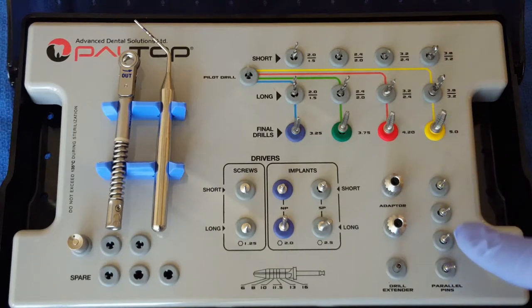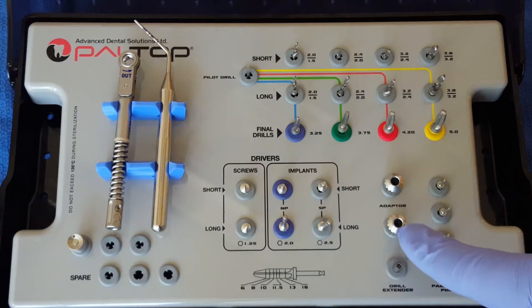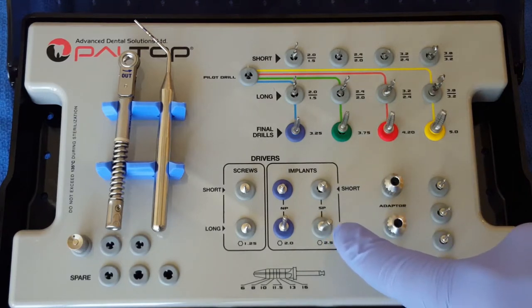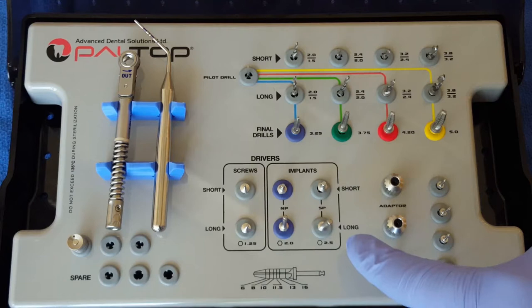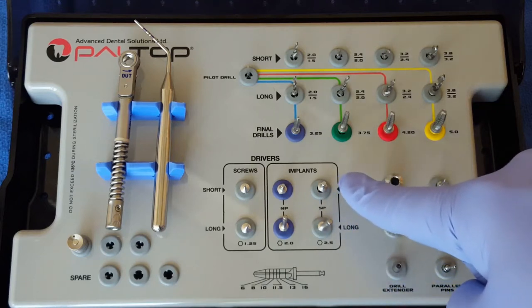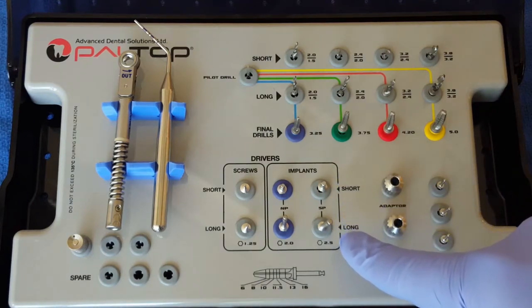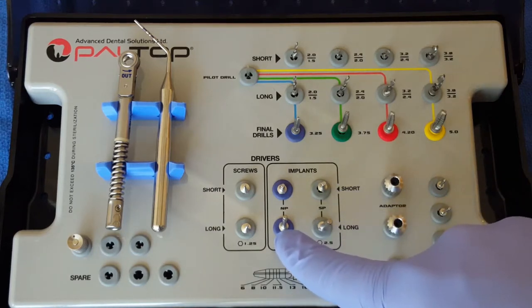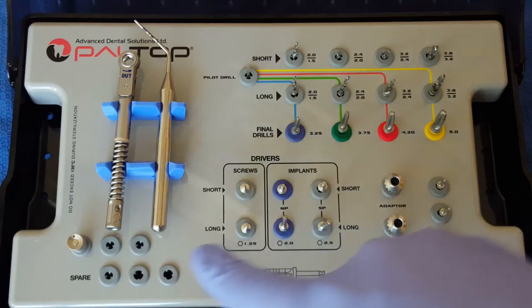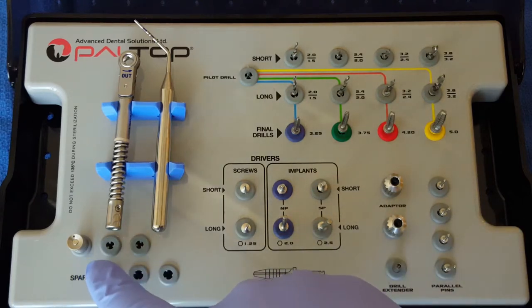It also includes parallel pins, adapter handles that are used with the implant delivery keys, as well as long and short screwdrivers. The delivery keys all come in a short and long variety, and they are both for the standard platform implants as well as the narrow platform implants.